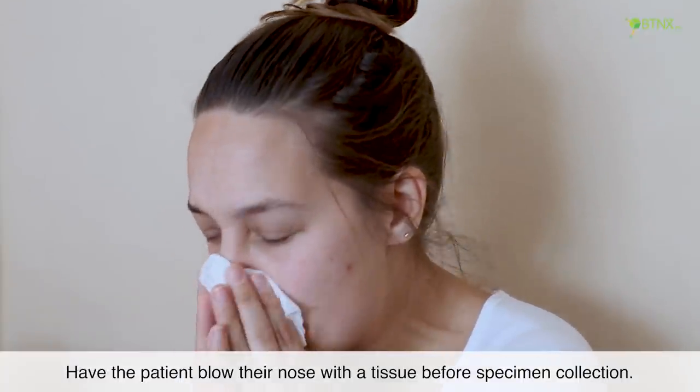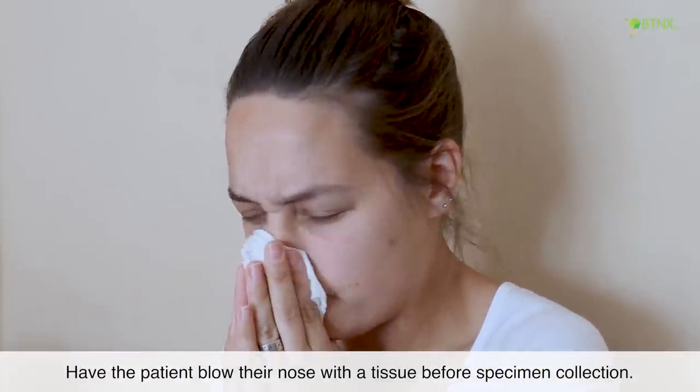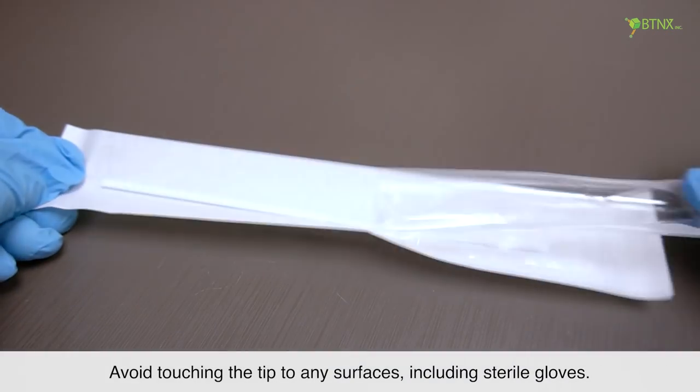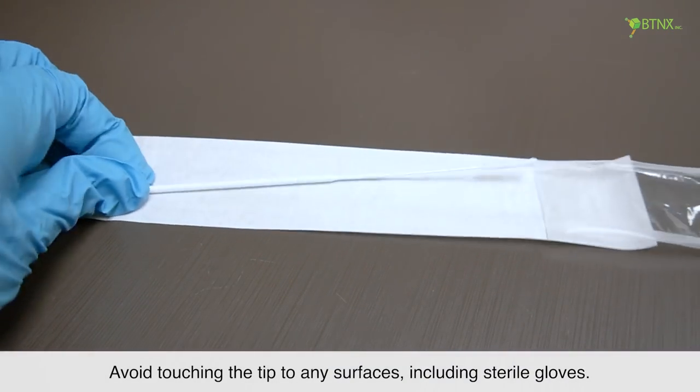Have the patient blow their nose with a tissue before specimen collection. Remove the swab from the packaging. Avoid touching the tip to any surfaces, including sterile gloves.